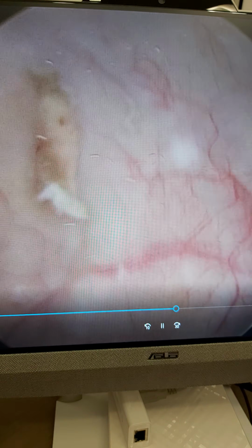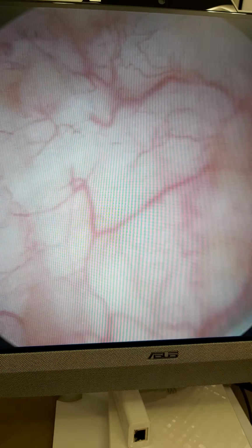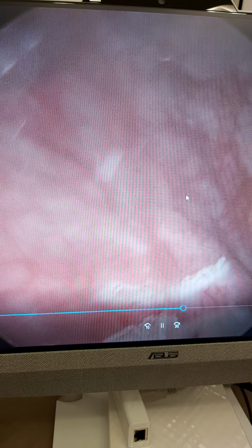We control the thickness of the bladder mucosa here, and it is quite enough to make a resection. So these are the resected particles. We take them out by vacuum cleaning of the bladder with our instruments. There are still some cystic tissues, but we don't want to make an extreme fulguration or extreme resection.